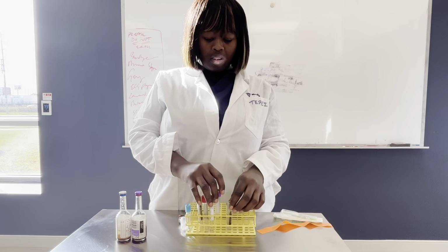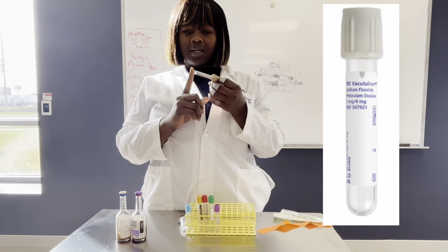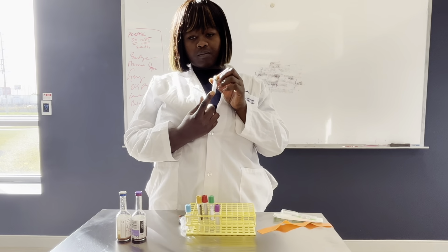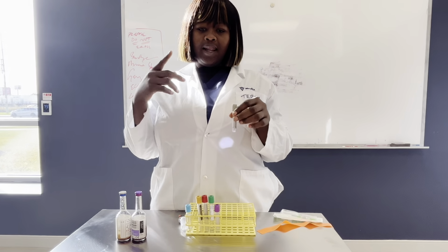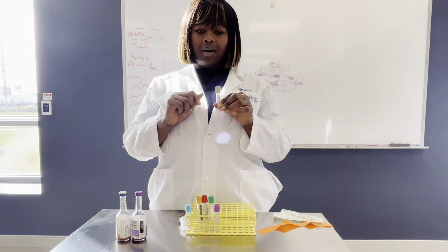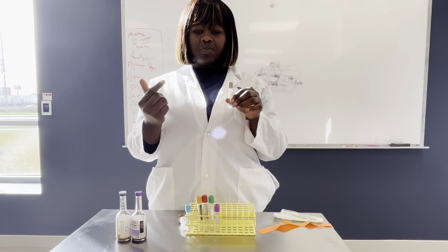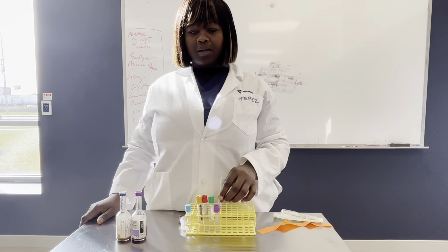So lastly, in the order of draw, we have the gray top tubes. These tubes include oxalate plus sodium fluoride. This combination serves two main purposes. It acts as an anticoagulant and also as a preservative for glucose levels in blood samples. It is used primarily for glucose testing and sometimes for alcohol levels in the blood.